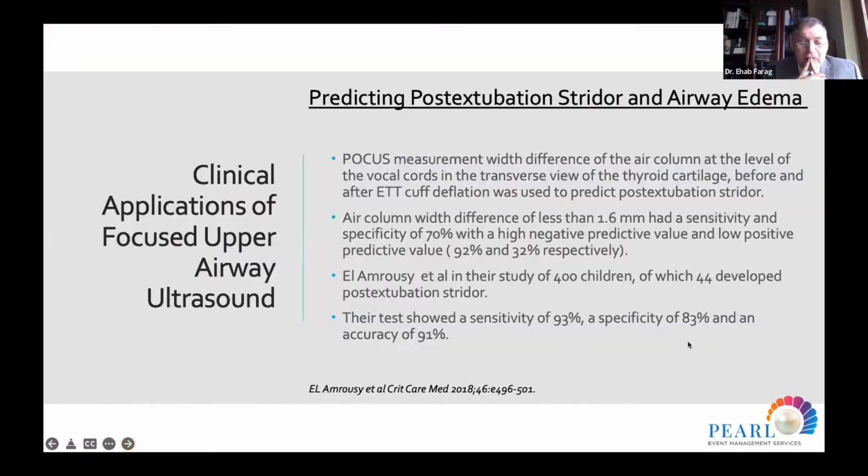The other important point is how you can predict the development of a stridor after extubation: prediction of post-extubation stridor and upper airway edema.